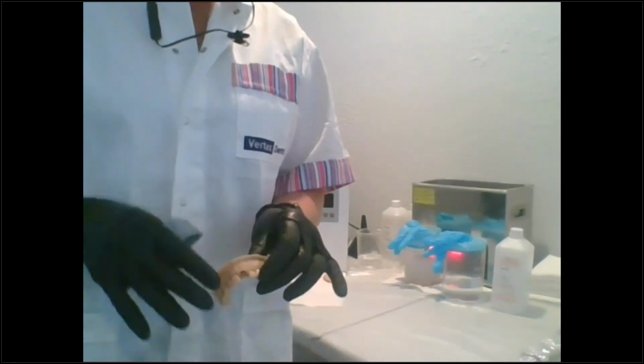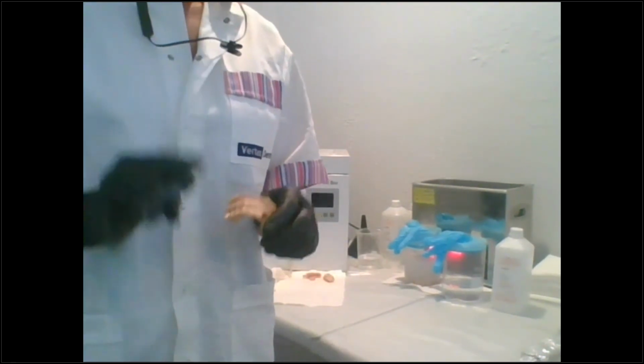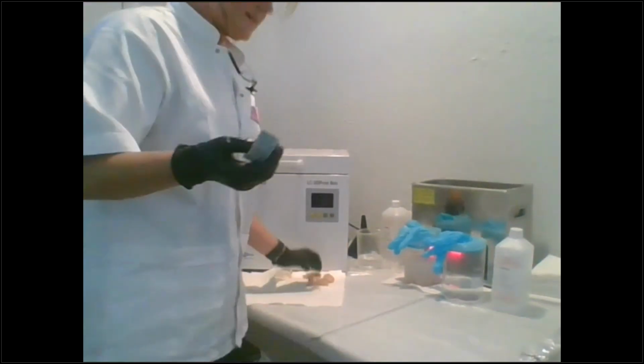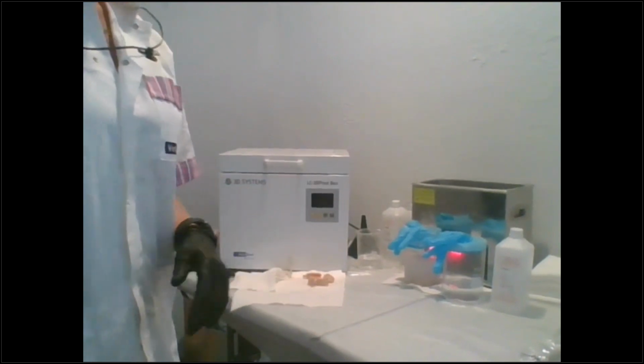Okay, so lab analogs go in, same with surgical guides, okay? So they go in before you do your post-cure. And you can just use resin to glue. Same with anything, really.